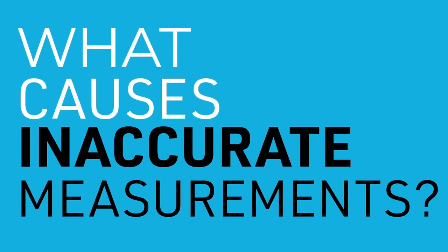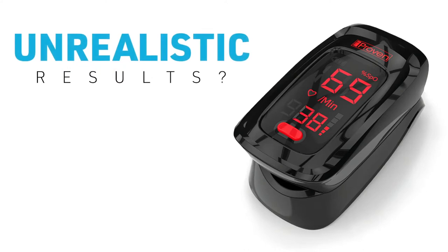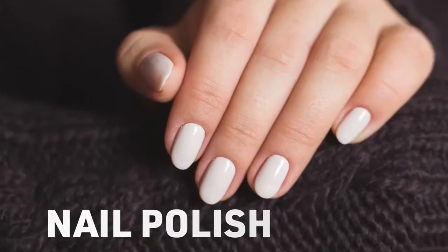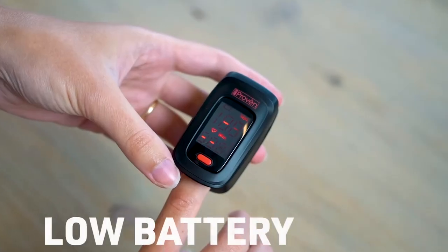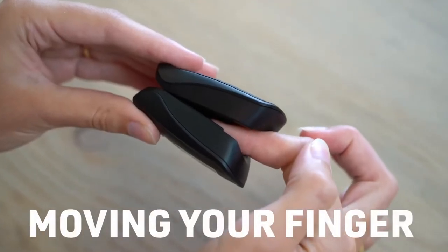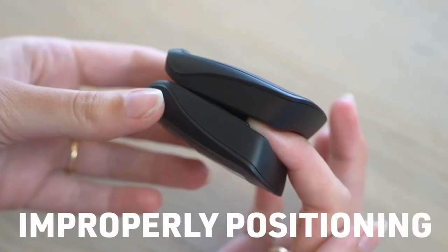What causes inaccurate measurements? When the numbers displayed on the oximeter seem unrealistic or even absurd, try to measure again. Make sure to pay extra attention to the following, since these may cause inaccurate measurements: nail polish, cold fingers, excessive ambient light, low battery, moving your finger around inside the device, and not properly positioning your finger inside the oximeter.